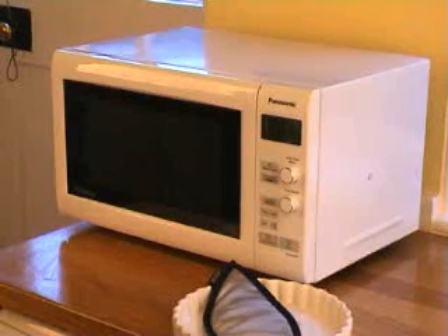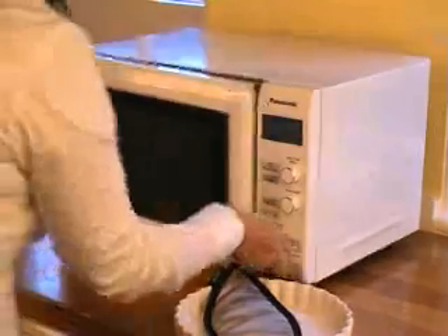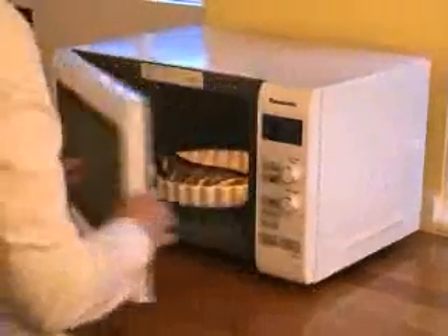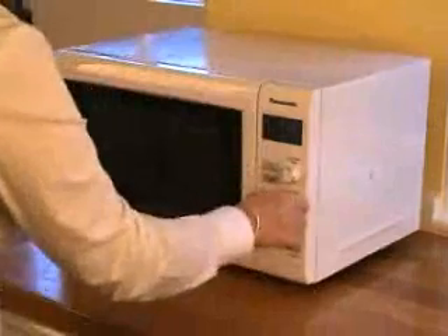Choose a convenient place to lie down and relax for 5 to 10 minutes. Put your eye bag in a clean microwavable dish. Place the dish in the middle of your microwave and heat on the high setting for 30 to 40 seconds.